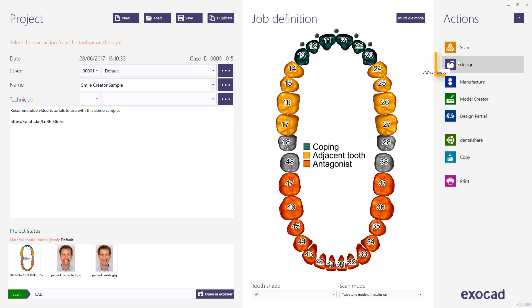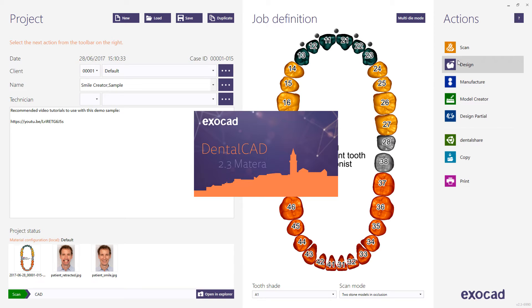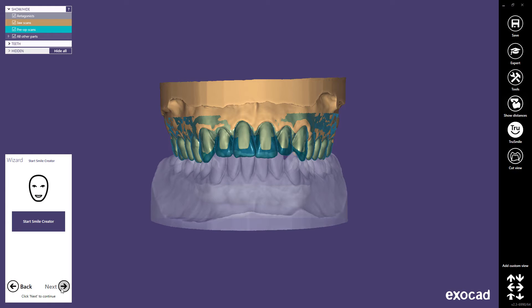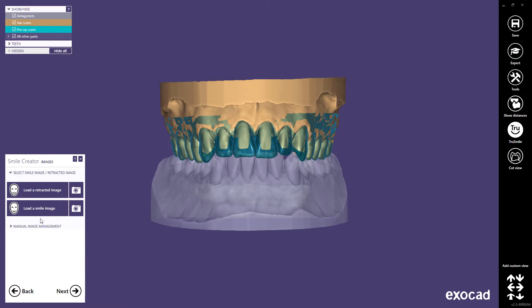Choose Design from the action menu to start the CAD application. The software automatically starts a wizard that will guide you through all the work steps. Skip the Correct the pre-op scan position step by selecting Next — this will be shown in a separate video. Click on the Smart Smile Creator button to start Smile Creator. Note, it is also possible to start Smile Creator at any stage and for other restoration types by selecting Smile Creator from the Tools menu. We can proceed by only using the Smile image, which is a faster approach, but we recommend using a retracted image as well to capture all the necessary information.